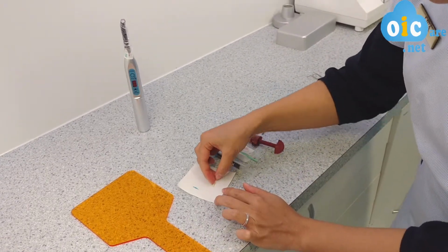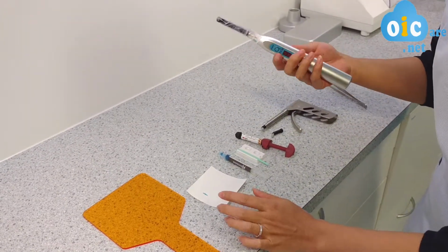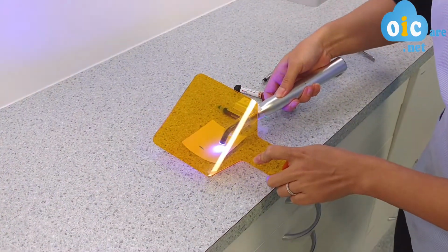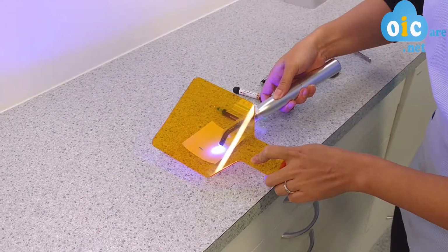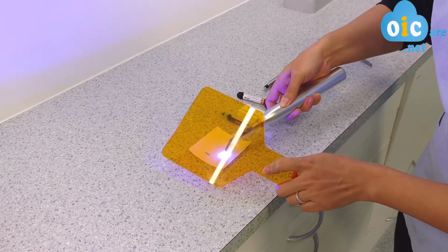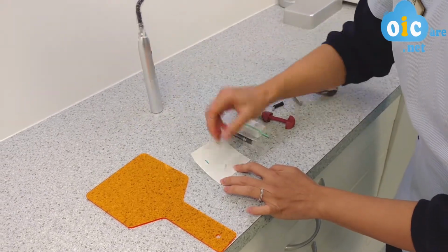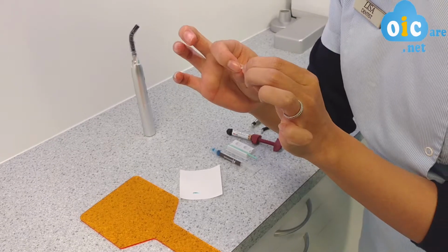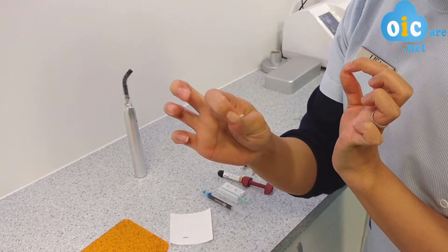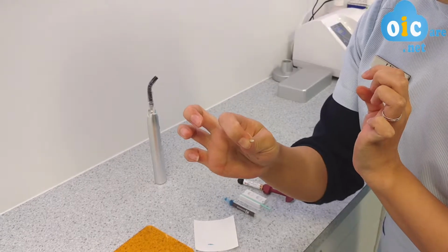After I have shaped it into the desired shape, let's just do a sausage as an example. Let's shine some light onto it for about 10 seconds. Usually we light cure for 10 to 20 seconds, depending on the thickness. It has had 10 seconds of light. Have a look, it's gone hard. I can no longer bend it. It's no longer pliable. This will replace the tooth structure that you have lost due to decay.